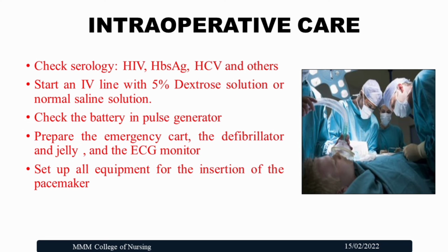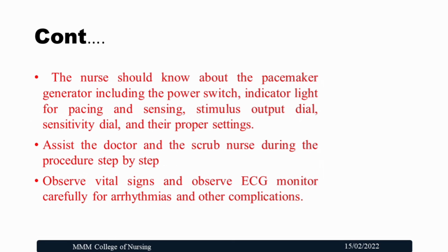The intraoperative nursing care is to check serologies like HIV, HBsAg, HCV and other tests, start an IV line with 5% dextrose solution or normal saline solution, check the battery in the pulse generator, and prepare the emergency cart, the defibrillator, jelly and the ECG monitor, and set up all equipment for insertion of the pacemaker.